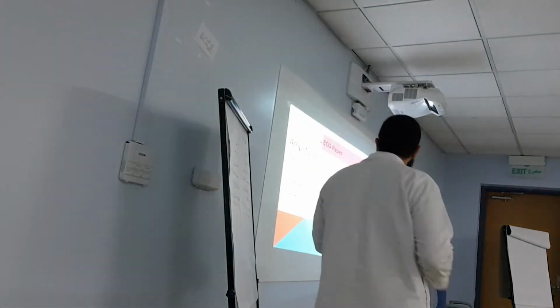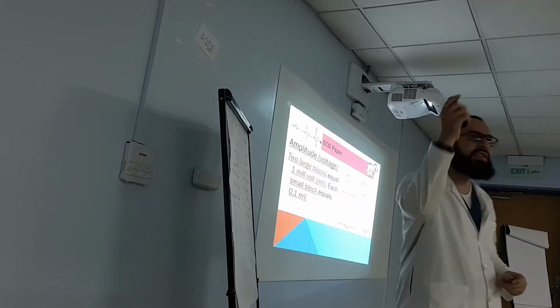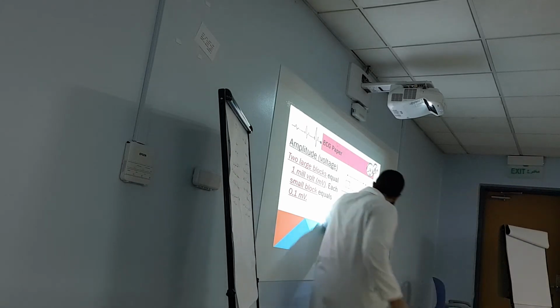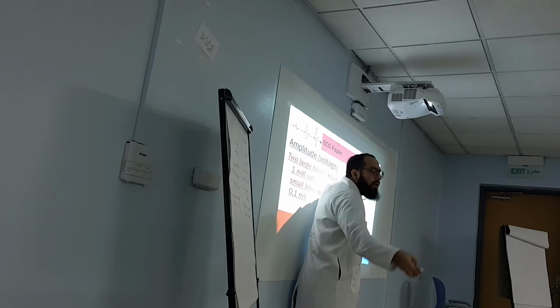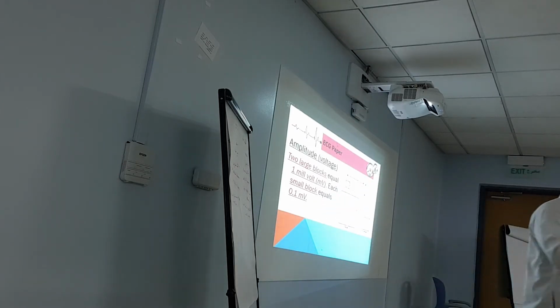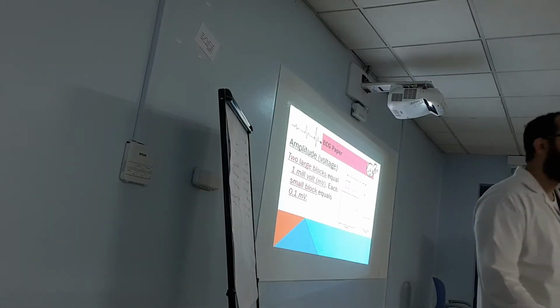Right. So why do you need it? Usually when you have ST segment elevation, if you heard about a patient having STEMI, MI, you diagnose how much the ST segment is elevated. The ST segment is supposed to be at 0. Now it is here. So how many small squares? 4. So that is 0.4 millivolt elevation of the ST segment. That's why when you diagnose it, it should say above 0.1, 0.1 or more. Some books say 0.2 or more. 0.2 what? 0.2 millivolt. Okay.